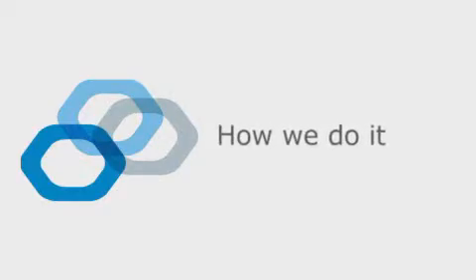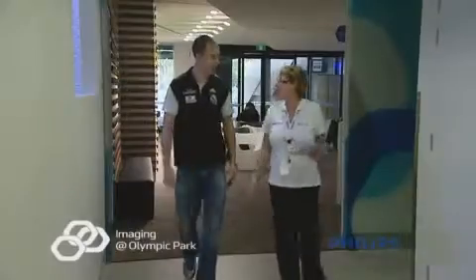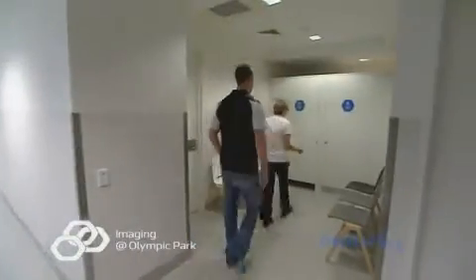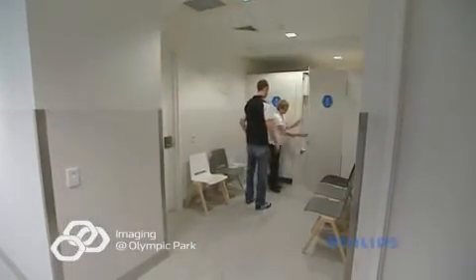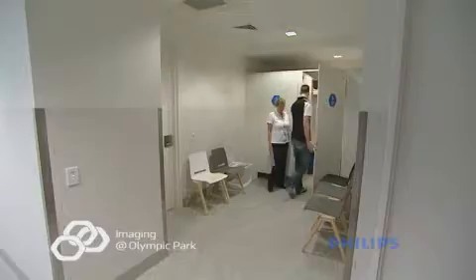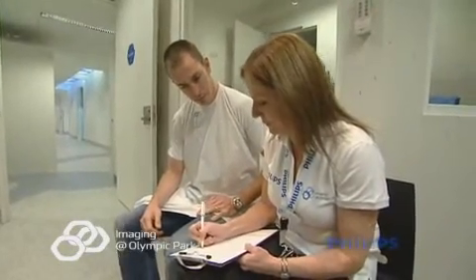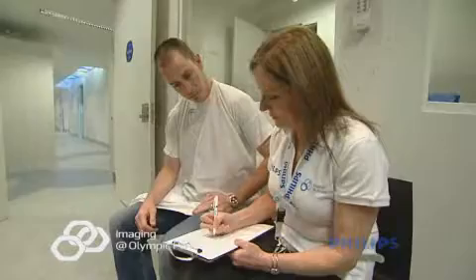How we do it. Our radiographer or nurse will call you through to the CT section of the department where you may be asked to change into a gown but leaving your undergarments on. Our nurse will ask some questions regarding your medical history and possible allergies, discuss the risks and possible complications.